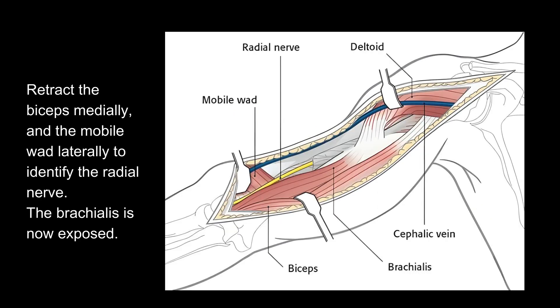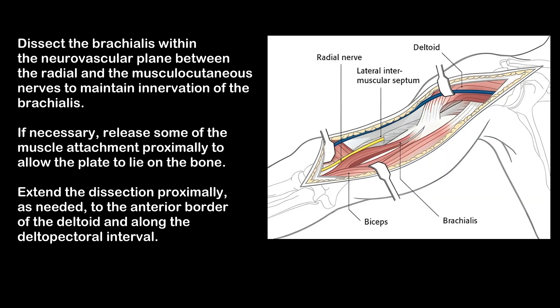Retract the biceps medially and the mobile wad laterally to identify the radial nerve. The brachialis is now exposed. Dissect the brachialis within the neurovascular plane between the radial and the musculocutaneous nerves to maintain innervation of the brachialis.